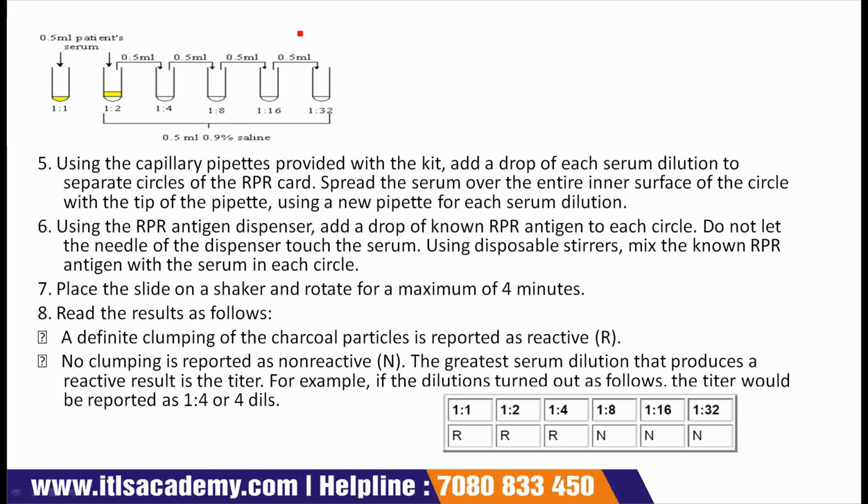After final dilution, after discard, using the capillary pipettes provided with the kit, add a drop of each serum dilution to separate circles of the RPR card.